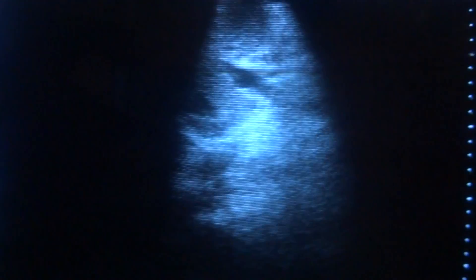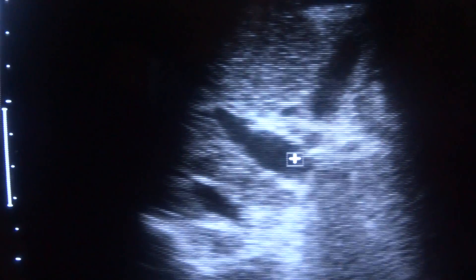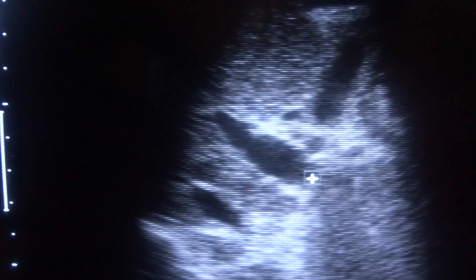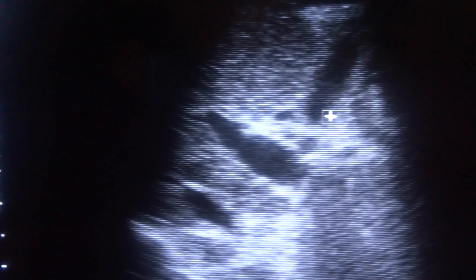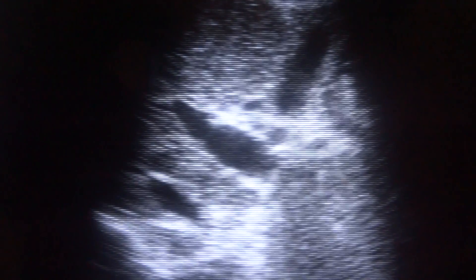This is an ultrasound of a cirrhotic liver. Here we see the portal vein, the gallbladder. This is the portal vein, this is the gallbladder, this is the liver, this is the IVC, and here it is being surrounded by the liver.